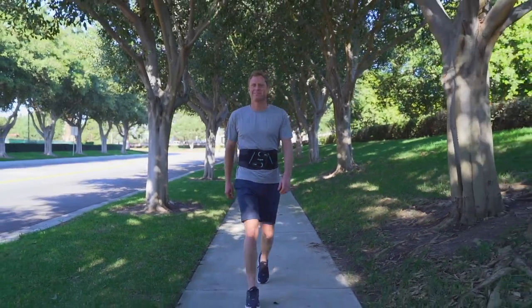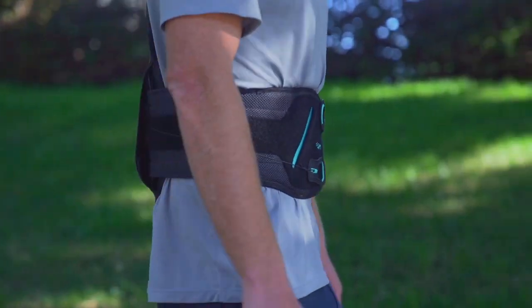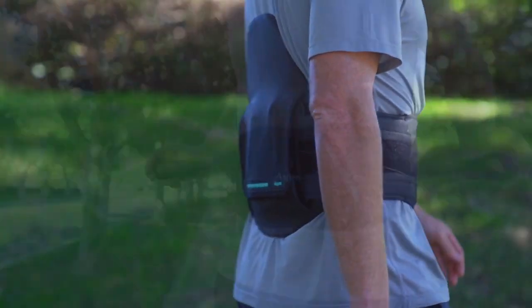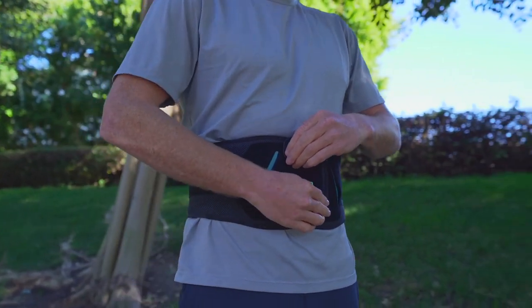An upgrade to the Horizon Classic line, the Horizon Pro line is built on Aspen's market-leading technology and features a refreshed sleek design and upgraded features for improved patient care and comfort.